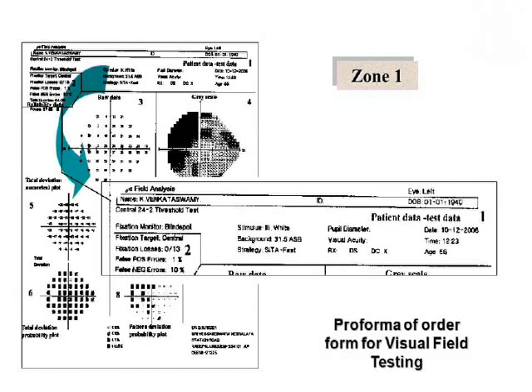And what is the size of the stimulus? The size 3 or size 5. And this is what we feed to the computer.